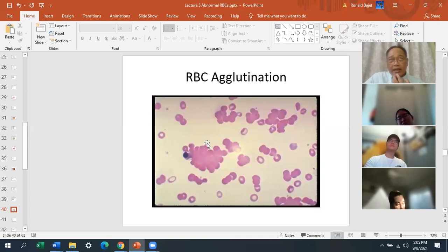So that's why it's good when you're on the bench and you have things that are suspicious. It's legal for you, and it's not HIPAA. You can call the floor and say, I have a problem with this CBC. Can you tell me what the patient's diagnosis is? I'm troubleshooting a specimen. And they should be able to tell you. I hope they haven't gotten stricter on that. But when I was on the bench and I had really screwy abnormal CBC results, I would call the floor and ask, what's going on with this patient? Can you give me a diagnosis? And whatever they told me would make sense.